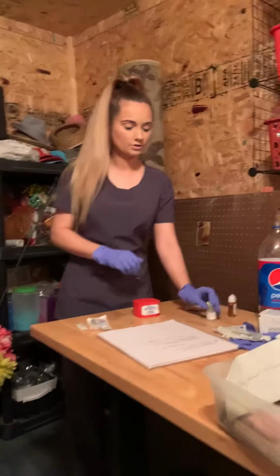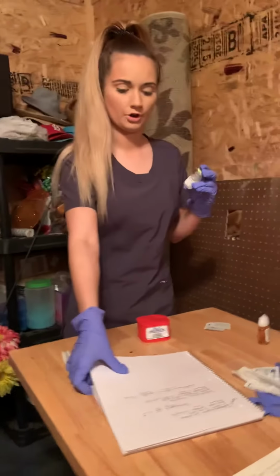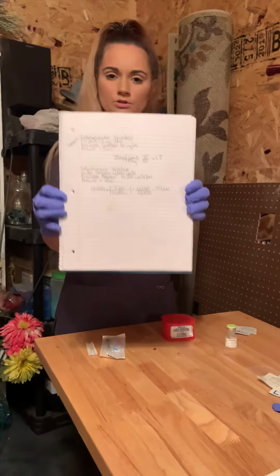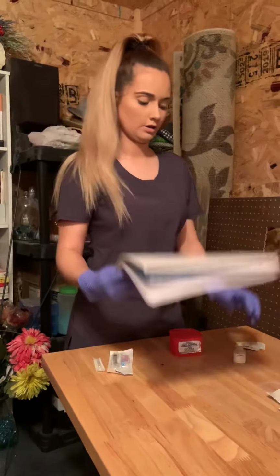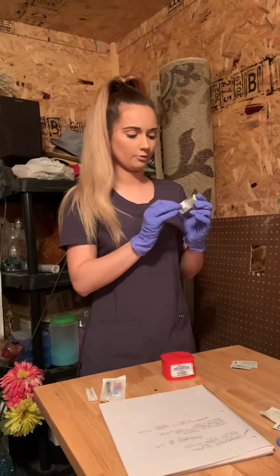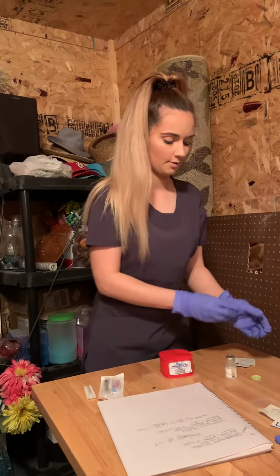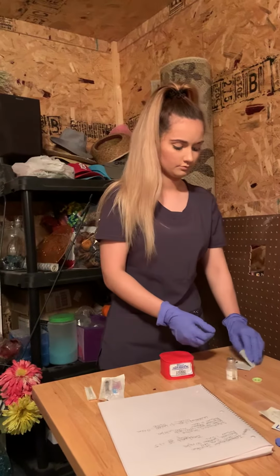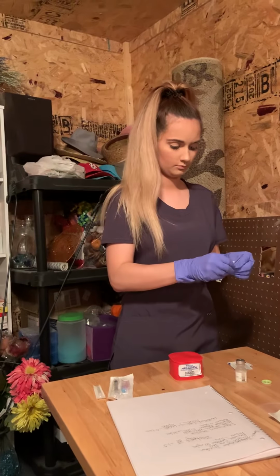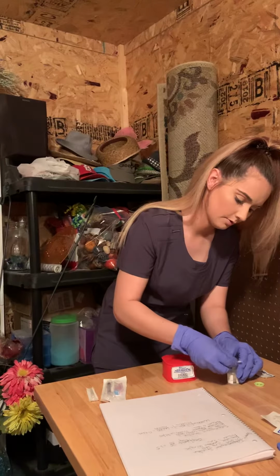And I will first look at the vial. I will look at the name, and I will compare it to my MAR sheet, which is right here. I'll make sure I have the right medication, and I will make sure that it is not expired. So I will take the cap off. Take an alcohol swab and clean the top of the vial.